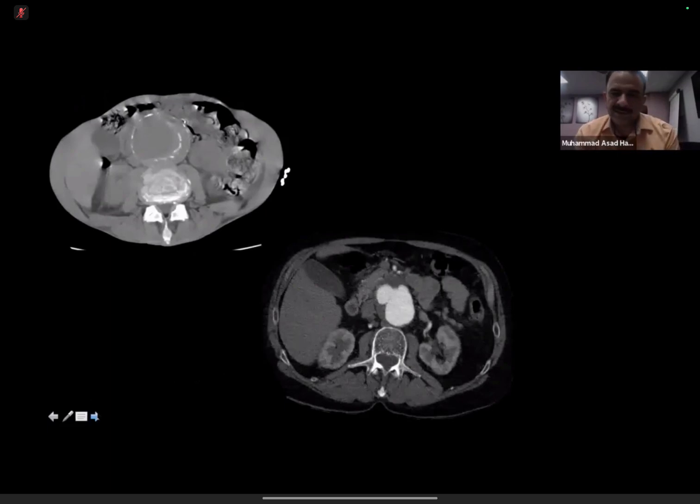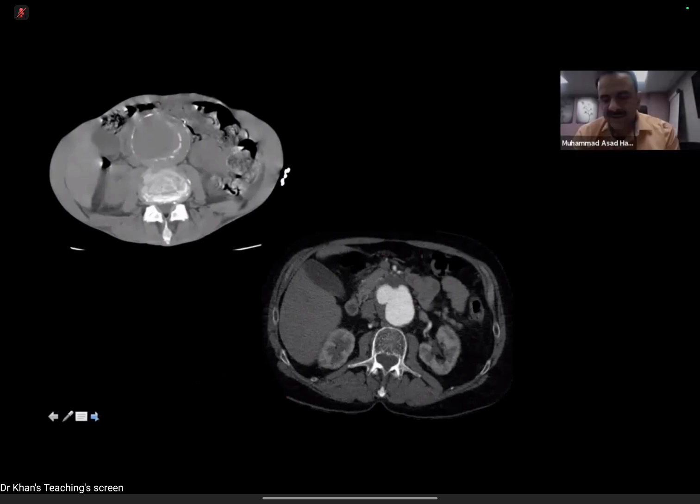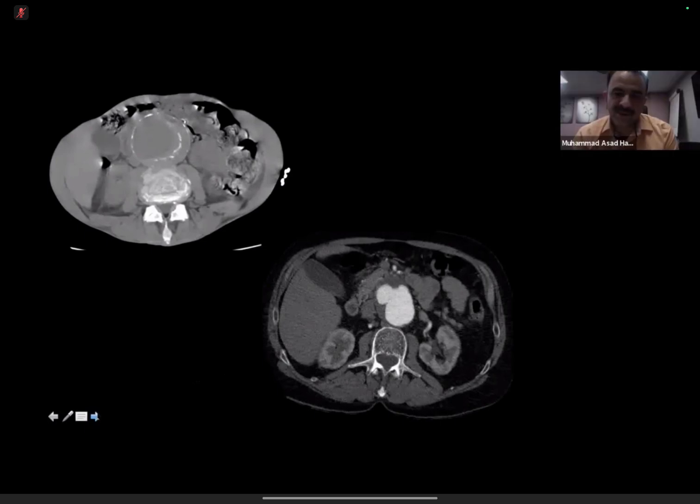The other thing which is normally commented upon is ulcerating plaque, which is shown in the bottom right image. As you can see, there is an intraluminal thrombus within the aneurysmal sac, but some of the contrast has actually started to invade through this thrombus. So this suggests a local ulceration within that intraluminal thrombus, and it puts more pressure onto the aortic wall, and it's impending rupture.